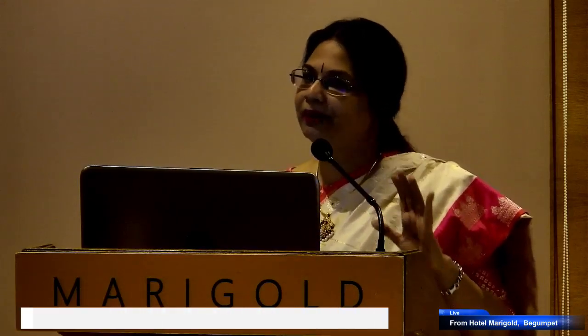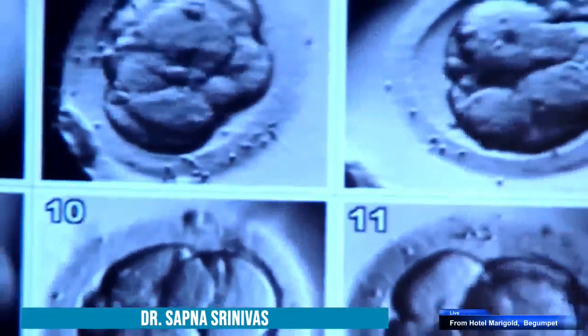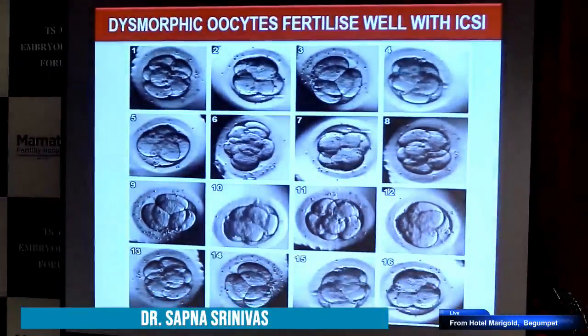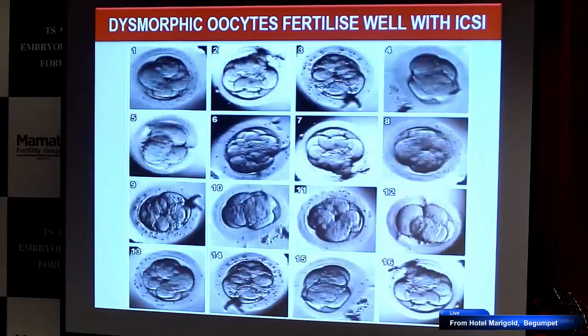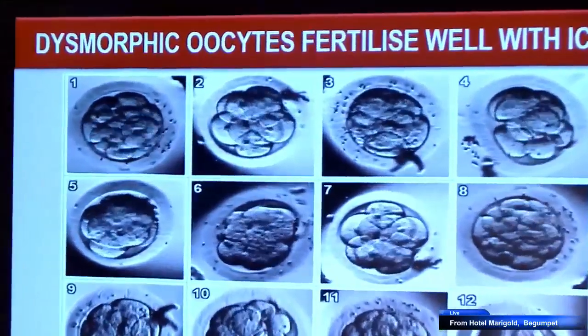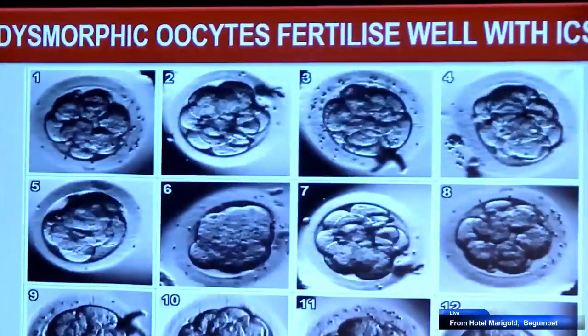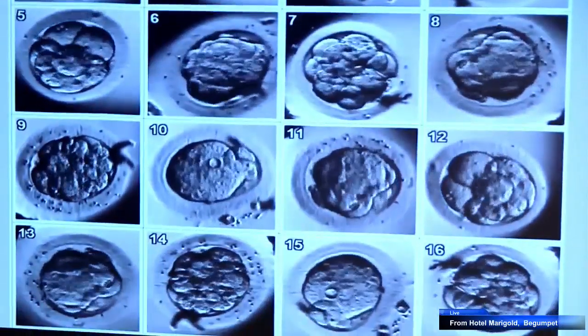Now, one thing to remember at the back of your mind is that when there are severe dysmorphisms, these oocytes in nature, in IVF, don't fertilize very well. So nature somehow takes care of that, because sperm binding, cytoskeletal competence, sperm fusion to the plasma membrane, and also fertilization are all dependent on several cascades that have to go right. Whereas when we start doing ICSI, we're bypassing all this. So they do quite well, and therefore selection is important, grading is so important.